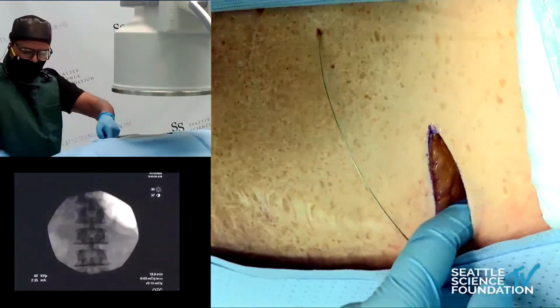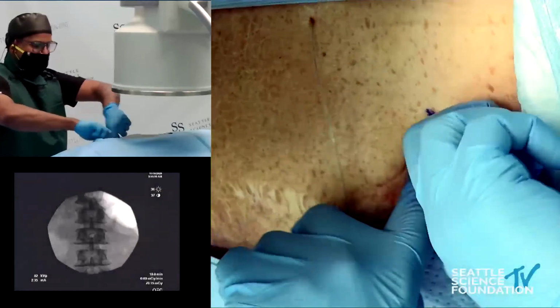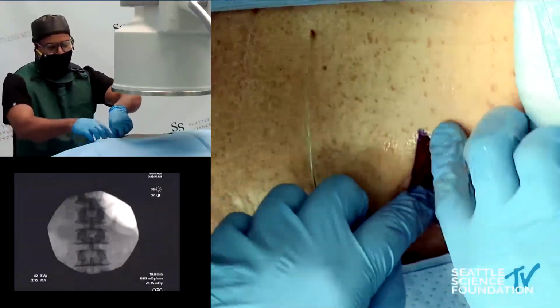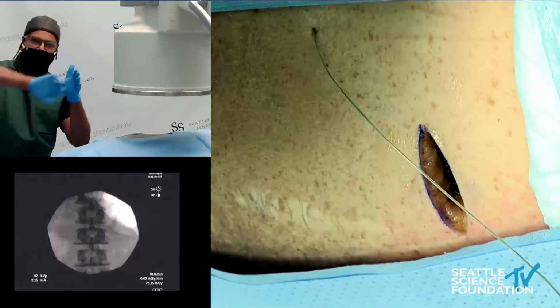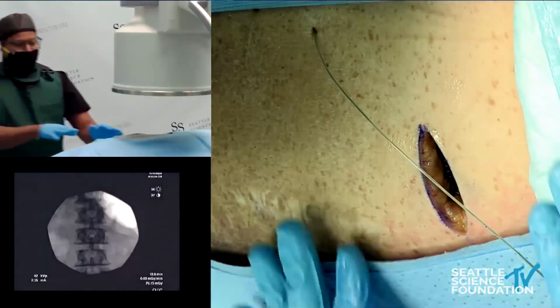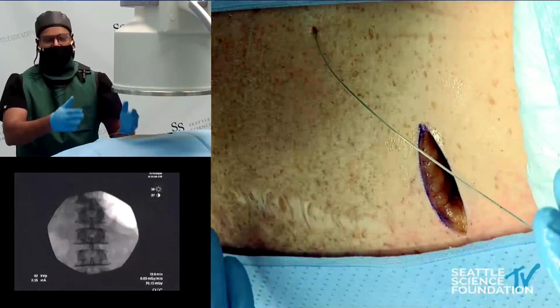Okay, perfect. And you'll often have a template, not the actual IPG itself, and you'll just want to make sure that template fits in nicely. And so I usually have my incision, there are different ways of doing this, sort of overlapping that metal silicone interface. Some people like to make the incision and push the IPG all the way down so that the incision's over it. It's really your choice, but the most important thing is that you don't have too much tension on that wound, right? Because you don't want this to dehisce, you don't want it to be susceptible to infection.